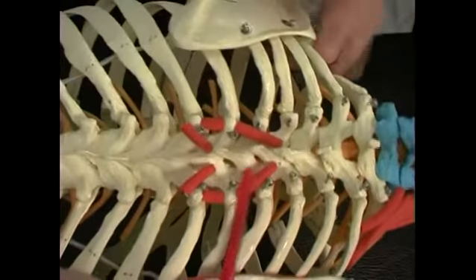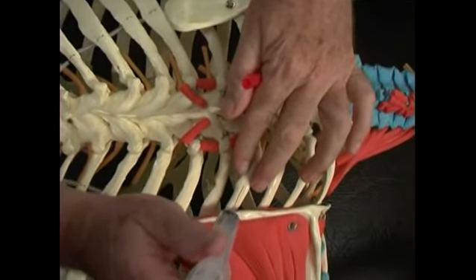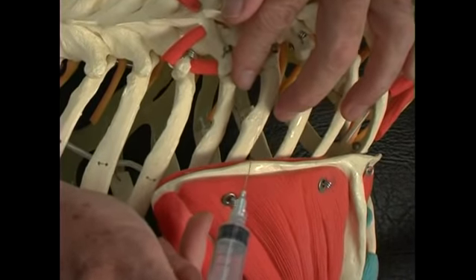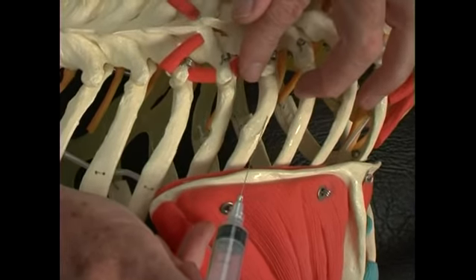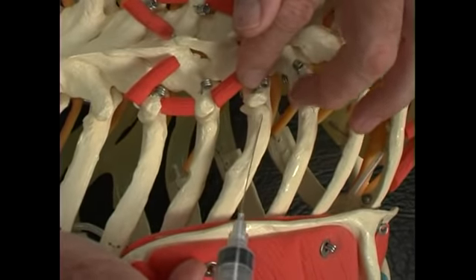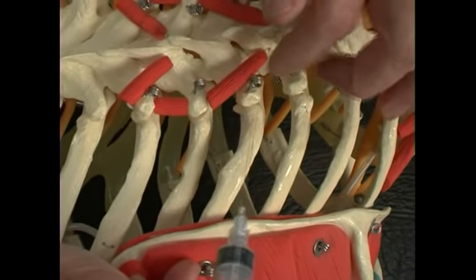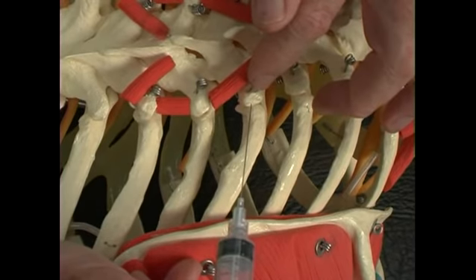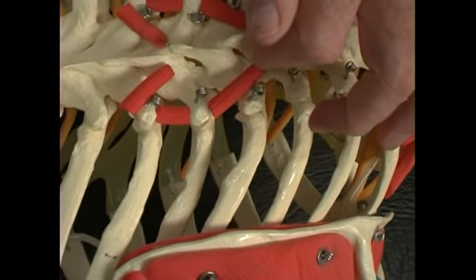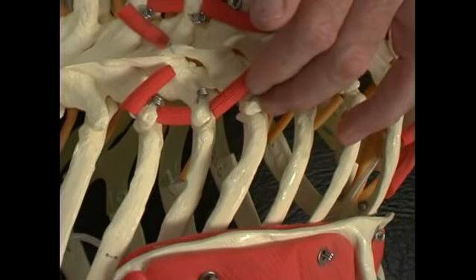And a final technique, which will be demonstrated in one of our videos, is to come into the angle of the rib and then bend the needle as we're coming across, bend the needle in and slide the needle across the rib like this, injecting small amounts of solution as we go till we get to the rib transverse process junction, where we then inject that area. This is an advanced technique that I certainly would not recommend initially when we're doing prolotherapy.